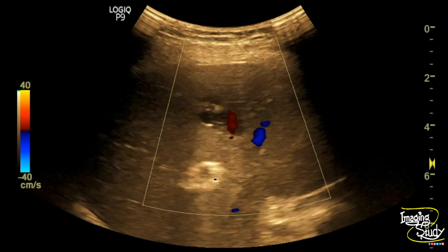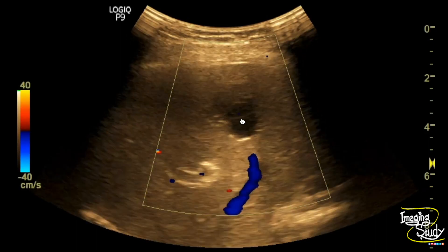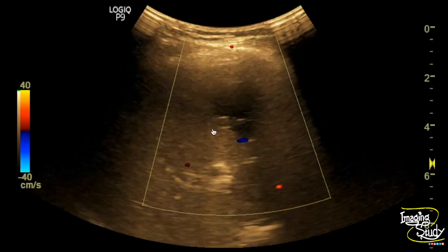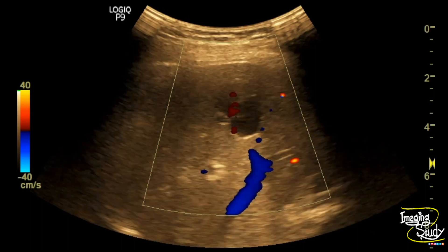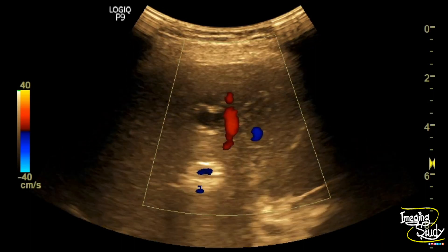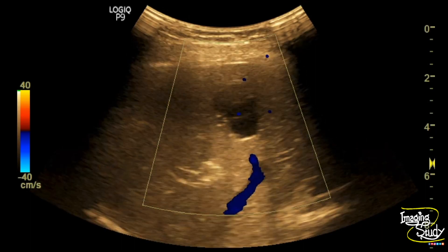On color Doppler you can see the normal vasculature and there is no abnormal flow within this cystic lesion. This will help exclude vascular malformation.